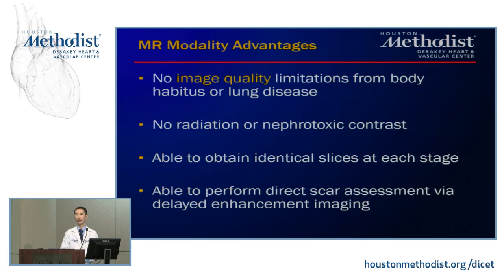We don't use iodine contrast. We use a gadolinium contrast. That being said, we do still have a limitation with kidney function because of the extremely rare risk of nephrogenic systemic fibrosis in patients with GFR less than 30.